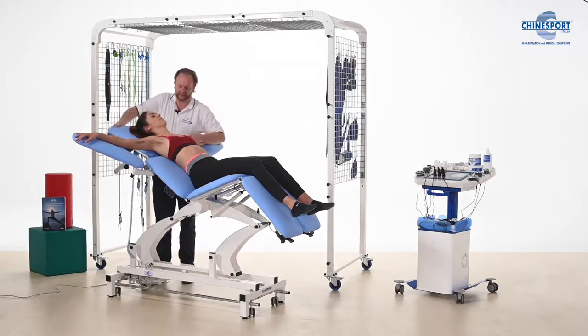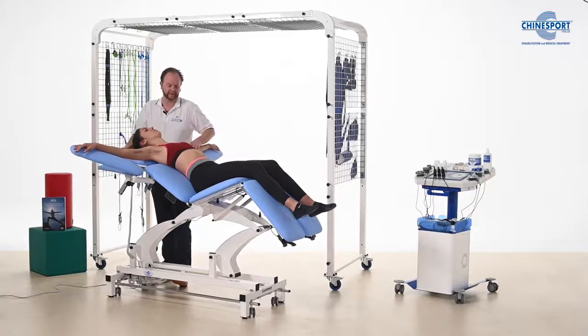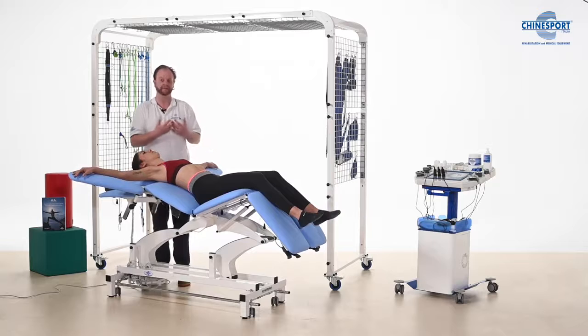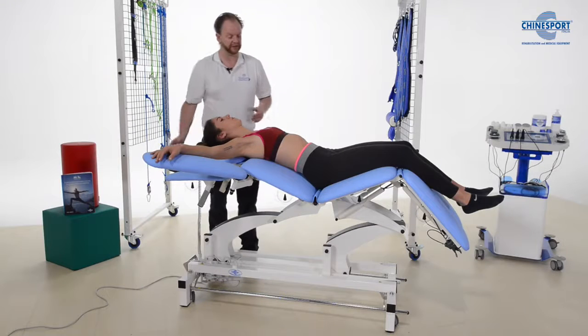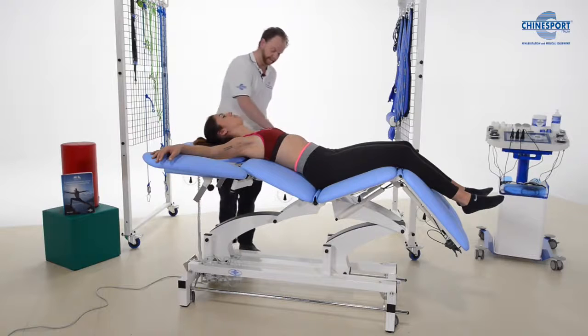We can go down a little bit and we can focus on the abdominal breathing. We can provide some more stretch, and if you want at this point in time we can also use some manual therapy, and we could, for example, just release the diaphragm, breathe in and breathe out. We just hold for a few minutes here as she breathes in and breathes out. And this should relax the patient and help the patient to breathe normally again, breathe through the pain, as it were.